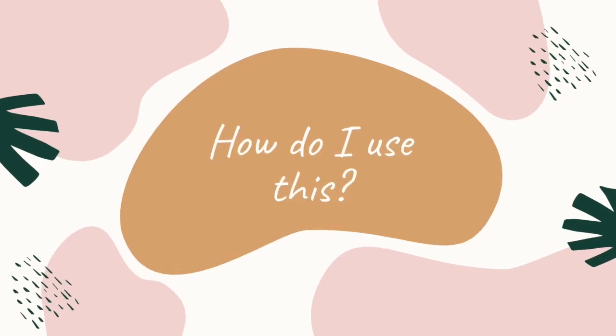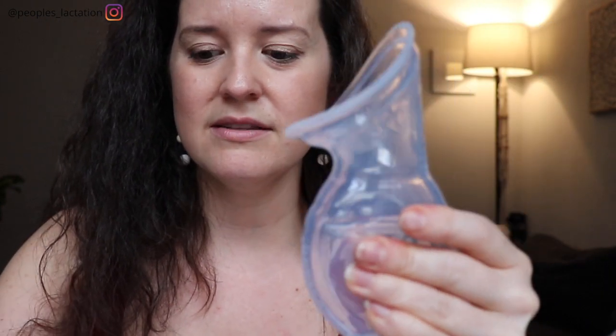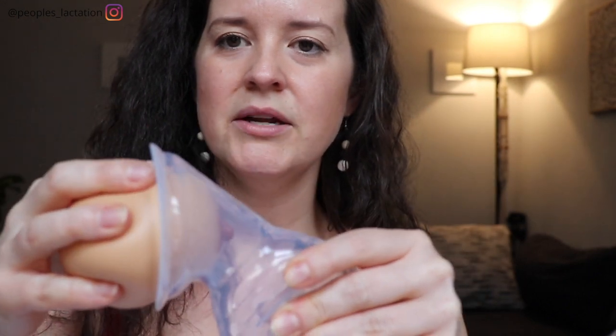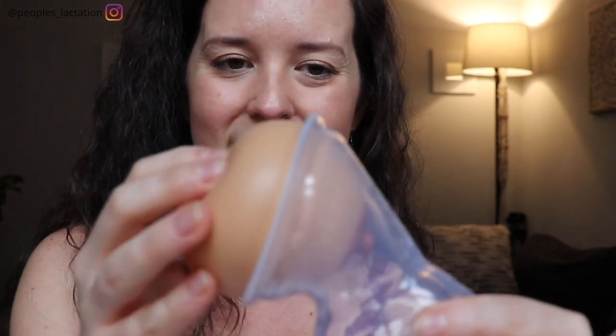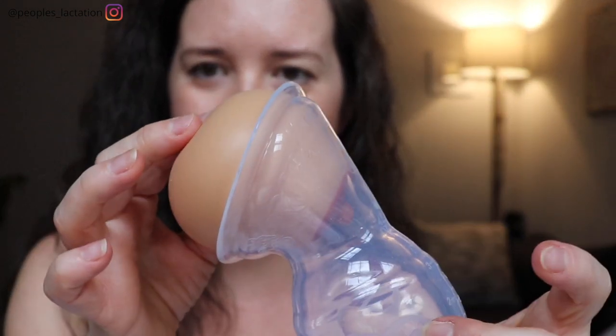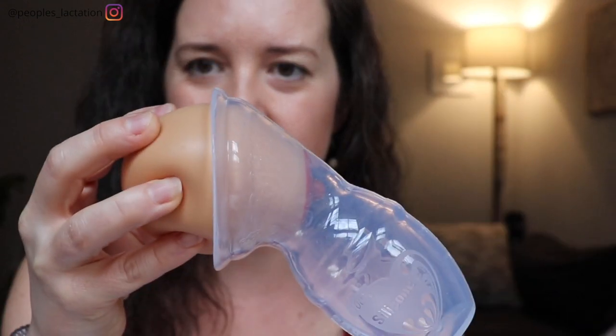Putting this on is really simple. It's a one-size-fits-all contraption — you don't have to worry about fitting yourself for a flange like you do with other mechanical breast pumps. The first way to form suction is to just squeeze the bottle part, place it over your breast under your nipple right in the middle, and release the suction. You're going to see it pulls the nipple down into it a little bit and it just stays suctioned onto the breast.